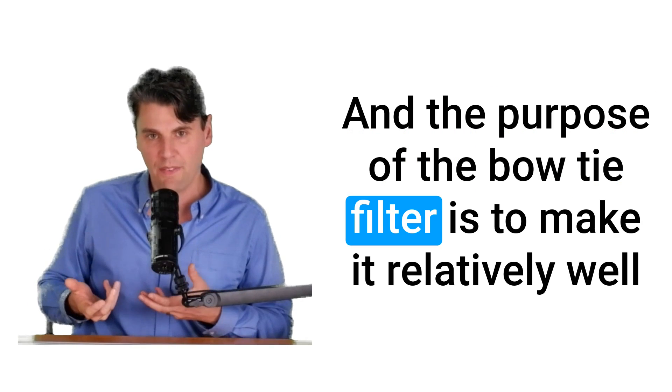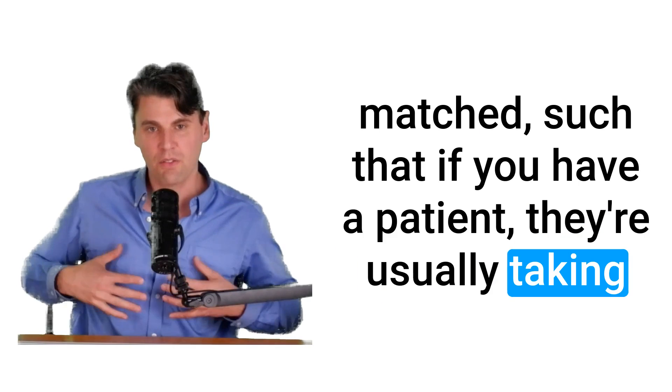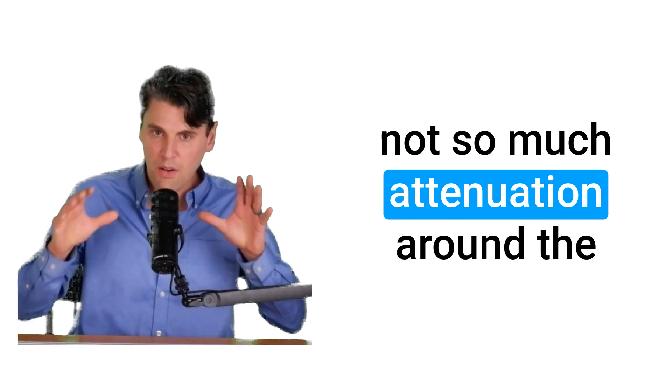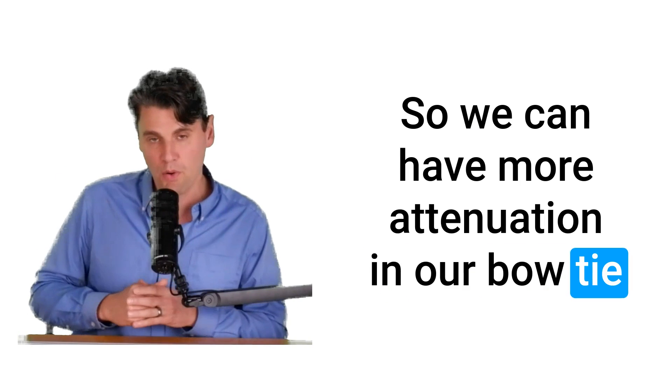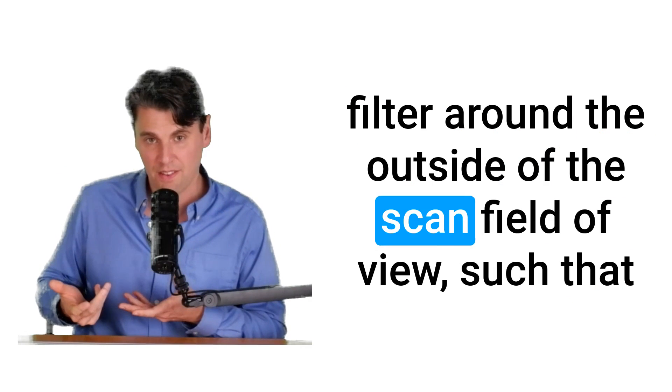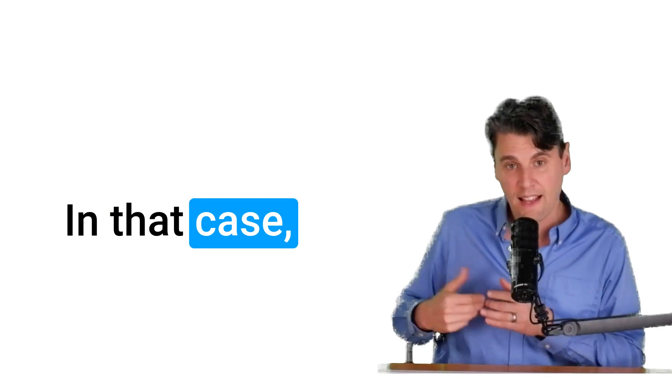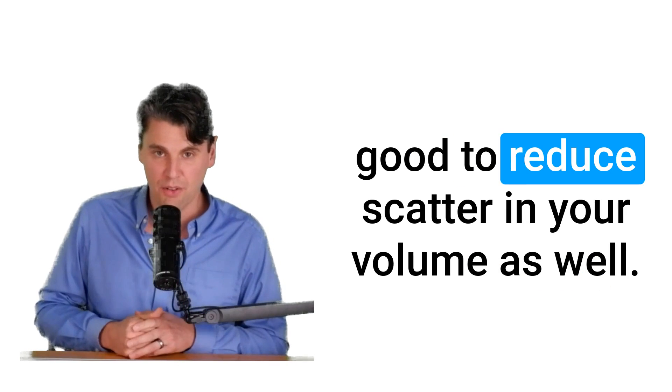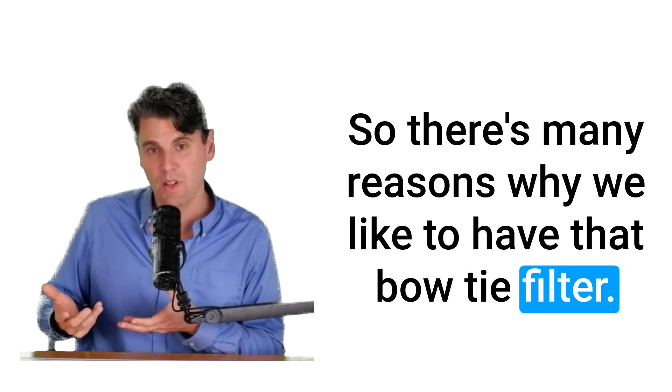And the purpose of the bowtie filter is to make it relatively well matched such that if you have a patient, they're usually taking up the middle of that scan field of view and not so much attenuation around the outside of the scan field of view. So we can have more attenuation in our bowtie filter around the outside of the scan field of view, such that we'll get a more similar fluence on the detector. In that case, you would need a lower dynamic range on your detector. Attenuating those extra rays also can be good to reduce scatter in your volume as well. So there's many reasons why we like to have that bowtie filter.